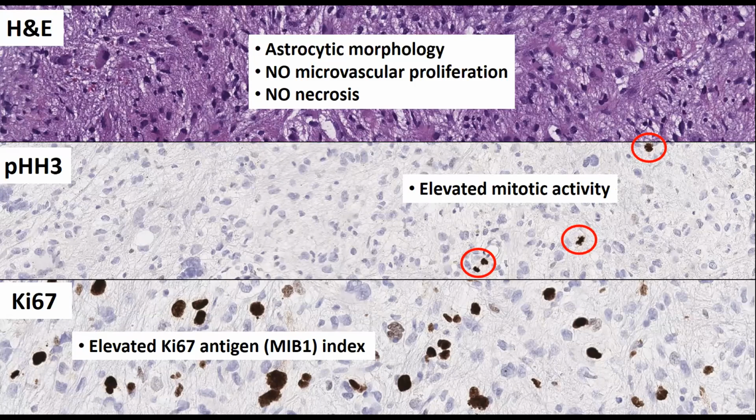One of them is in anaphase, right? You can see the bottom left. 3 mitotic figures. This is a piece of a 20x field. Yeah, this is plenty of mitotic activity in a single field to bump it up to a 3. Ki-67 is, we'll just call it brisk. That is a lot of labeling.